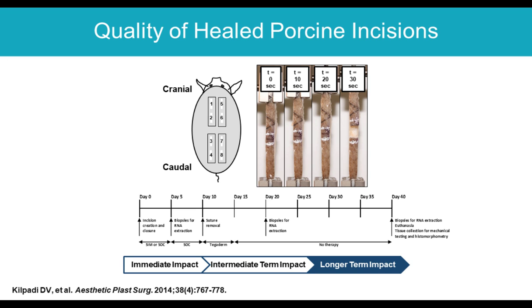If you go back to this study of the animals that were treated with negative pressure for 5 days, at 5 days the dressings were taken off, but they let these animals live for 6 weeks. And then at 6 weeks they harvested samples of the incision from underneath the dry dressing, which at this point was well healed. They harvested samples of the incision that were underneath the negative pressure dressings, which were also well healed. And they also harvested normal skin samples that had never had an incision.